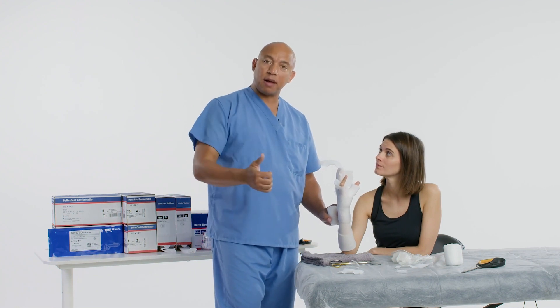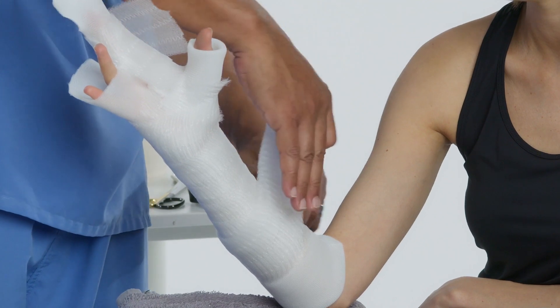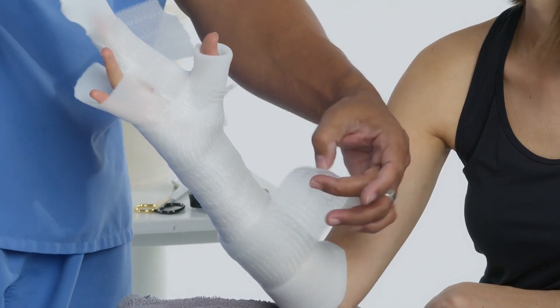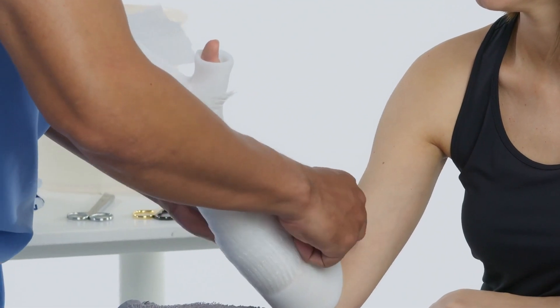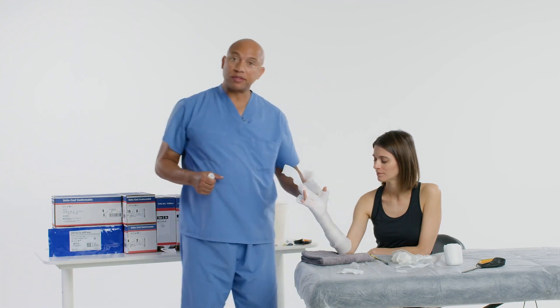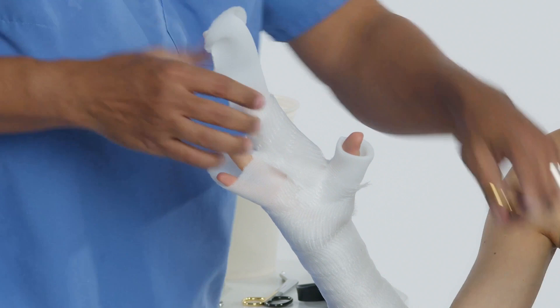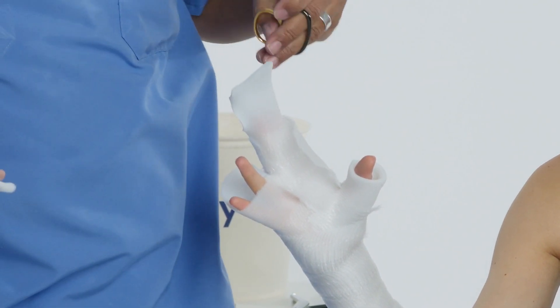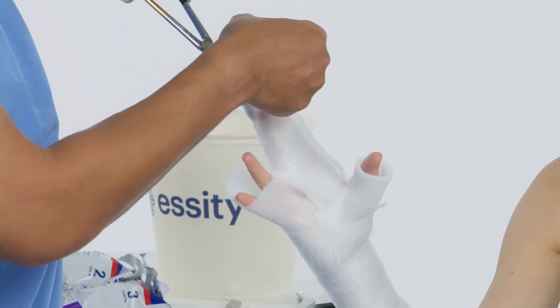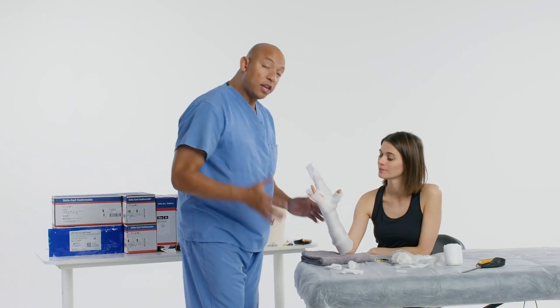As you place your Delta Dry padding roll on, make sure the tacky portion is facing up or away from the skin. I've covered it adequately but have some leftover — you can see this little memory the padding may have. Go ahead and tuck that underneath the little cuff you made. I'll also add a little slit here so I can fold it over on top of the cast tape. Now I have my stockinettes prepared and just need to add my cast tape.